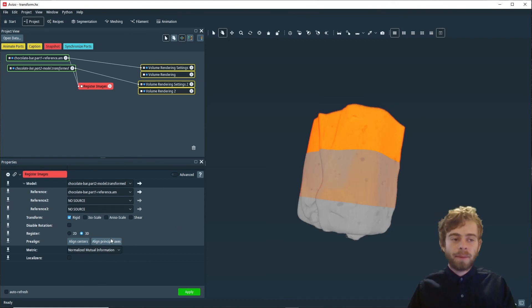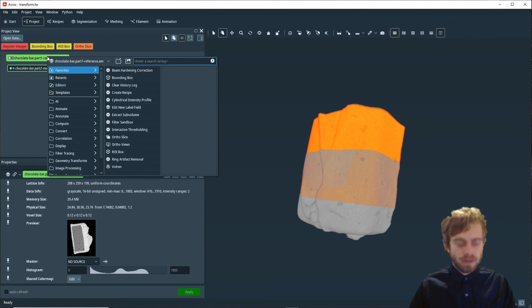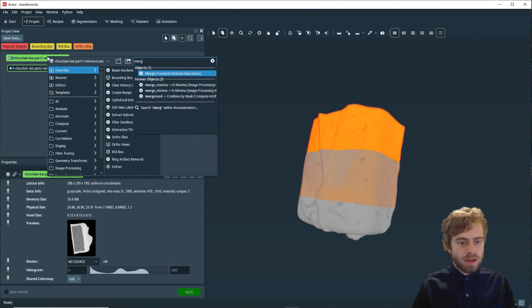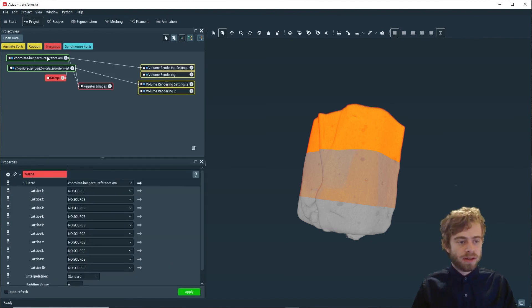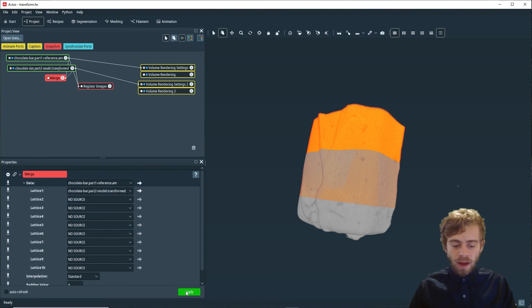Now we are going to merge the two images together. To do that, we're going to click on chocolate bar part one and search for merge, click enter, and we're going to choose lattice one to be chocolate bar part two, and we're going to click apply.